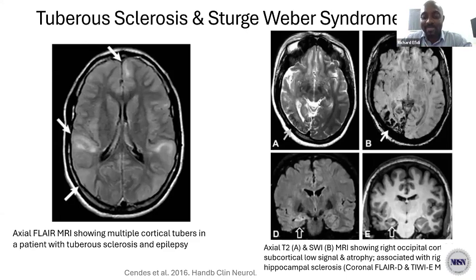If we must do MRI below 2 years of age, based on the harness protocol, which recommends the use of 3 mandatory sequences, T1 is actually the most sensitive for below 2 years, and is not so much affected by the presence of ongoing myelination. However, FLAIR and T2 become very poor in terms of their sensitivity. So with T1 weighted imaging, we may be able to detect a lot of cases of epileptogenic lesions in children below 2 years.